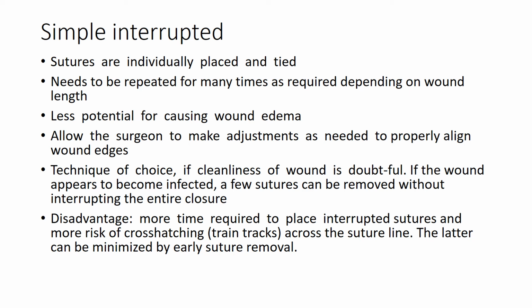This needs to be repeated as many times as required depending on the wound length. Simple interrupted has less potential for causing wound edema, and it allows the surgeon to make adjustments as needed to properly align wound edges. This is the technique of choice if cleanliness of the wound is doubtful.